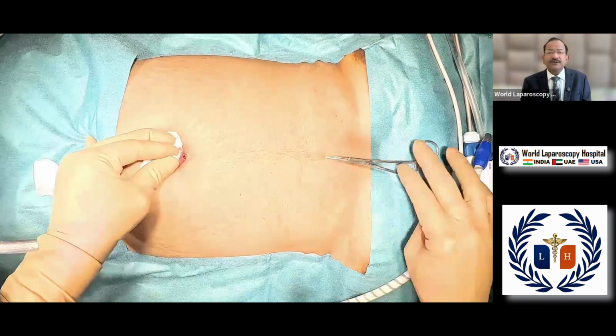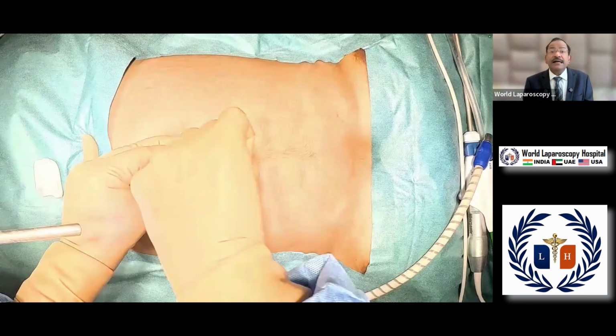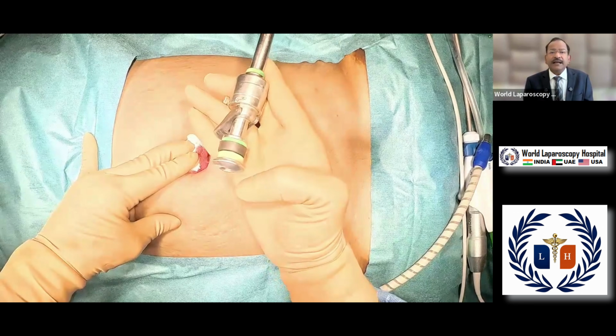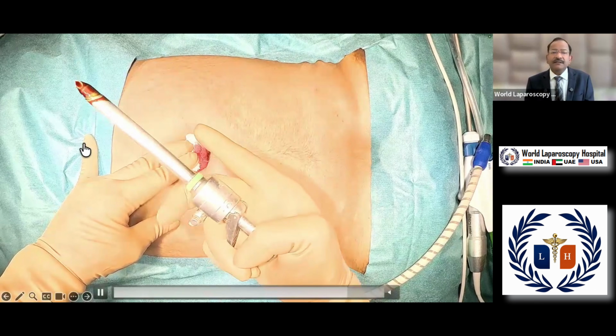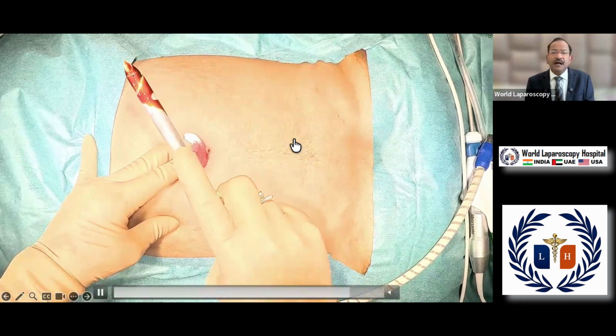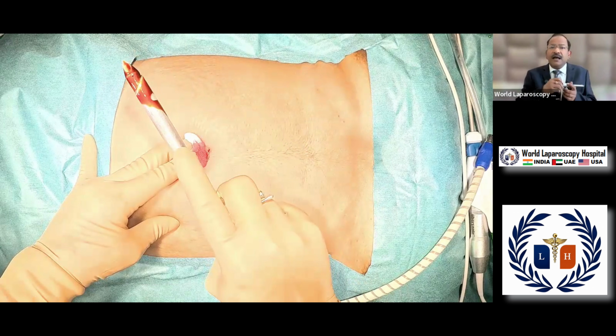And then you take a mosquito and dilate the obliterated vitellointestinal tract. That is called the Scandinavian technique. After that, hold the trocar like a pistol. This is the way to hold the trocar. How to hold the trocar? The thenar eminence should hold this way.